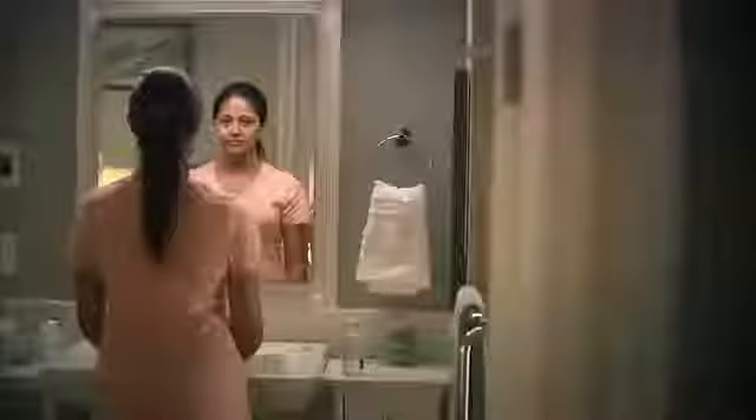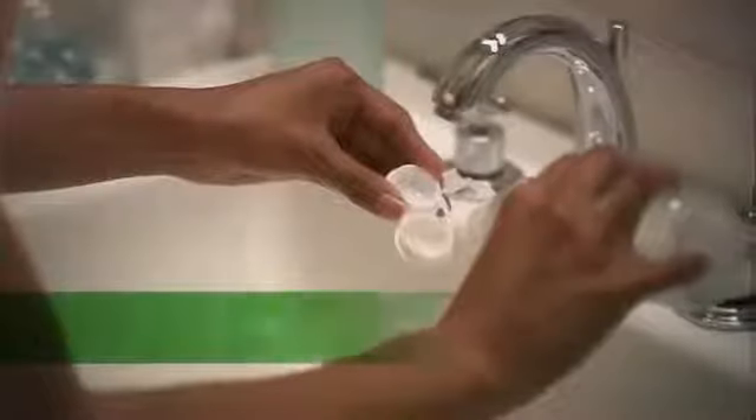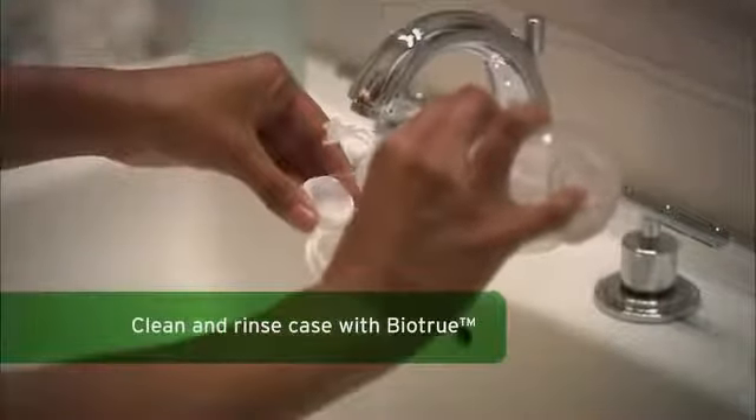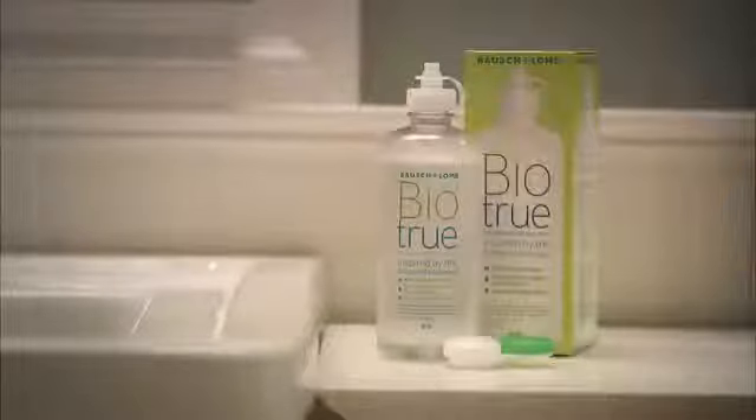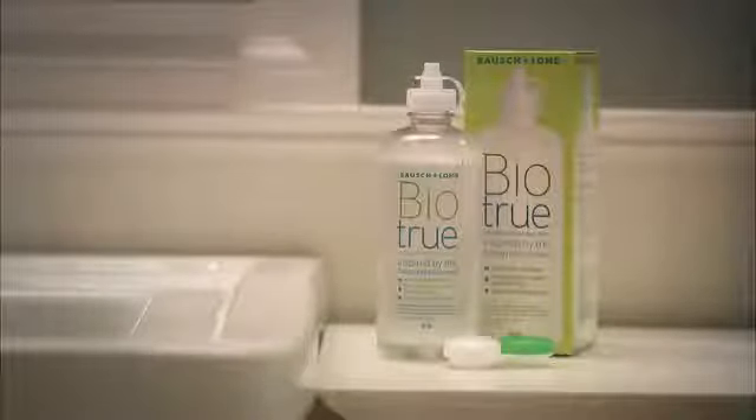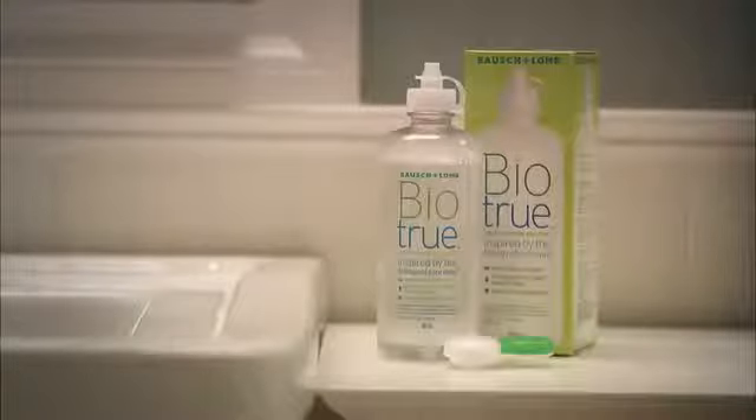While wearing your lenses, you'll notice the comfortable feeling that comes from using BioTrue Multipurpose Solution. Once you have applied your lenses, turn your attention to your lens case. After each use, empty your lens case and clean and rinse it with fresh BioTrue Multipurpose Solution. Never use tap water and never reuse Multipurpose Solution. Then just let your case air dry in a clean place — you can flip over your lens case while air drying. You'll also want to replace your lens case regularly. BioTrue Multipurpose Solution makes this easy by including a free lens case with every 10-ounce bottle.